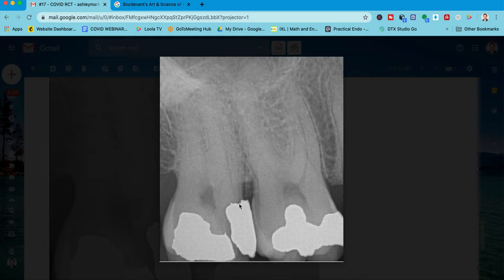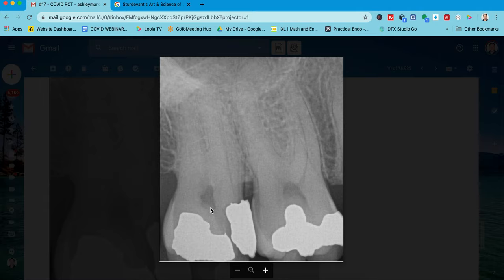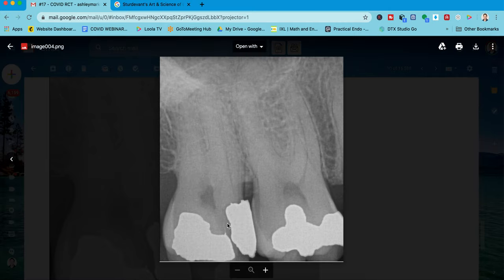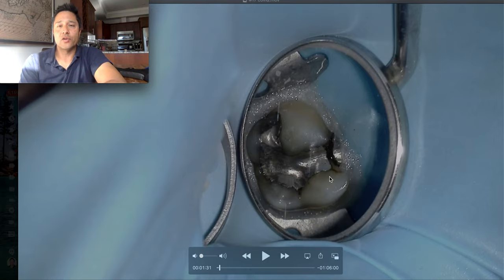So this case here presented just today, this morning, and this patient had been treated with pharmacotherapy for a couple of weeks and it's just not doing the trick. So the diagnosis is, after clinical testing, symptomatic irreversible pulpitis with symptomatic apical periodontitis on tooth number 17. You can see pretty much you fractured the restoration and he's been having decay and the tooth is now irreversibly inflamed. So we're going to do the endodontic therapy on this case and we're going to use our 557 burr.